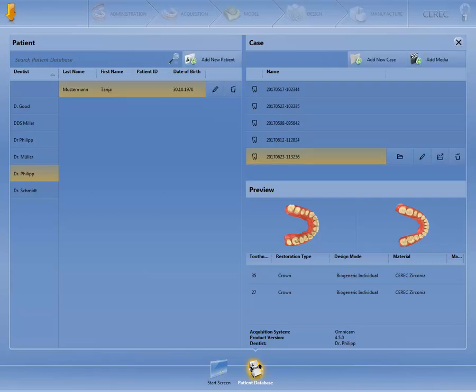The patient, together with all assigned cases, can be erased using the waste bin symbol. At this point, you can also add a new patient.